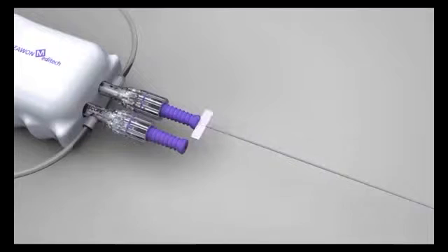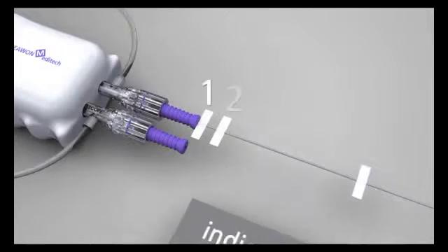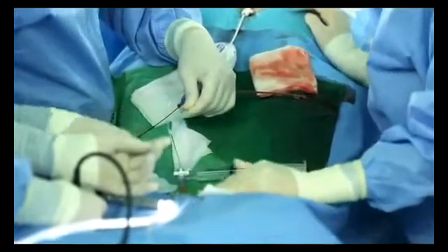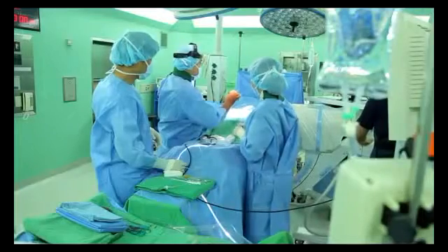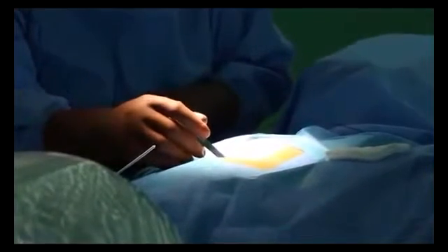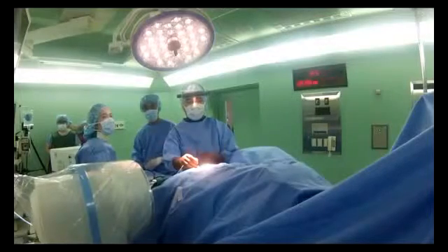Then, mark it with a steri-strip at 3 points on the laser fiber, and the distance between the 3 points should be checked frequently during the operation. Endoscopic cable may be adjusted to the best view on a case-by-case basis. You can see the approach procedure from puncture to getting to the target point. This part is the important process on which a successful operation depends.